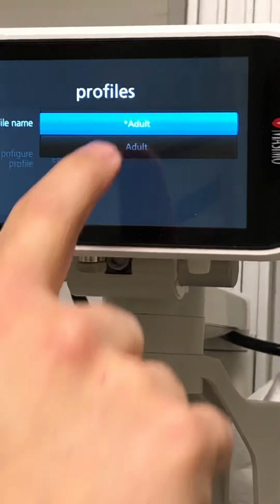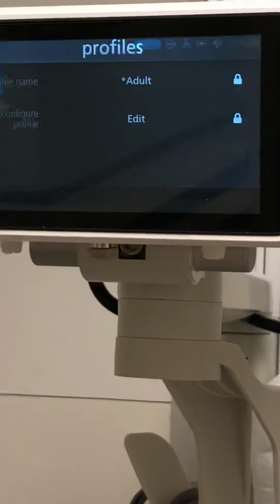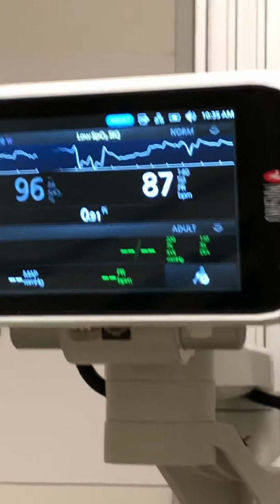You can touch there, put it back to the standard adult, say okay, and you'll see that the light blue background is now back. Or if you shut it off, we turn it back on again. Exactly. Okay.